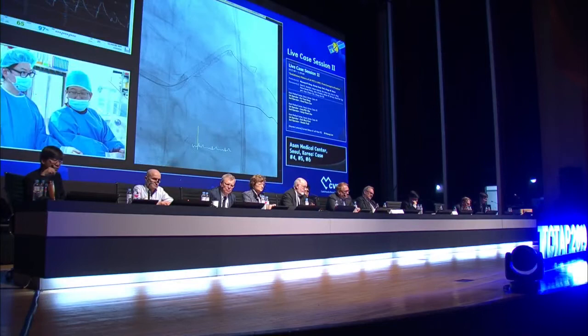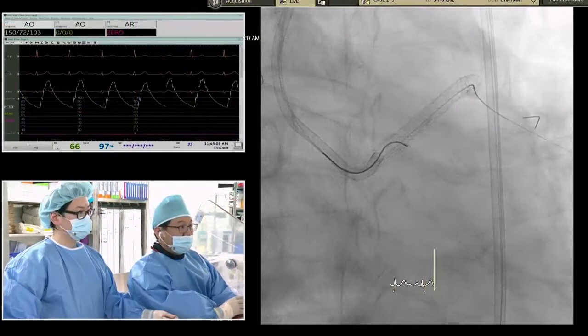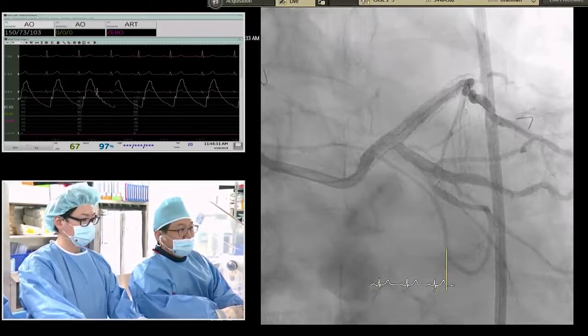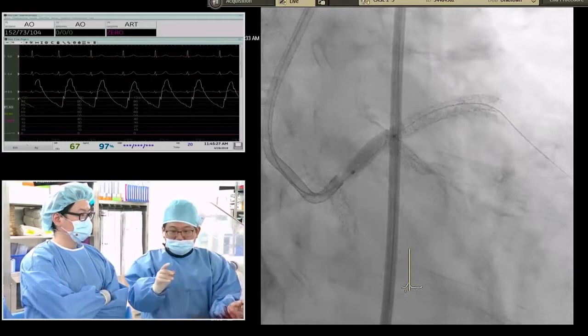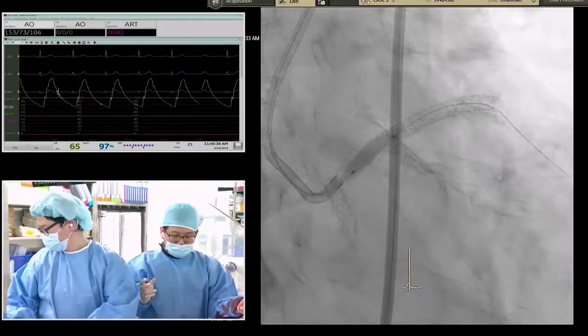Yes. Hi again. Yes, this is a high pressure balloon for the LAD side after the stent. I selected the LAD to left main stent, 4.0 by 20 millimeter, because the LAD vessel size is 4.0 and the left main is 4.6. So the maximum size is 4.0, and I selected it.